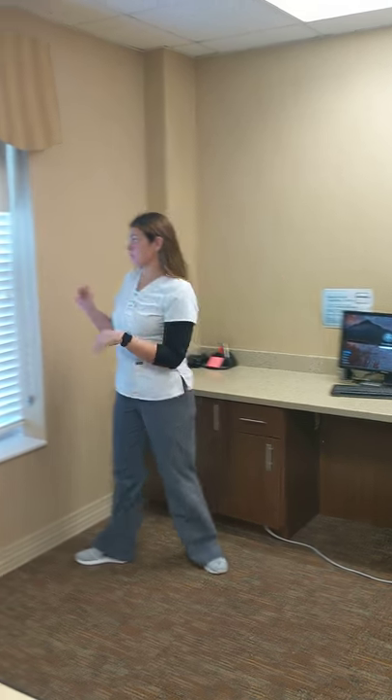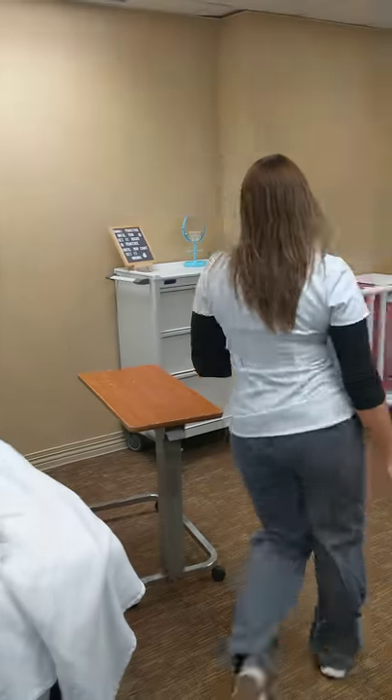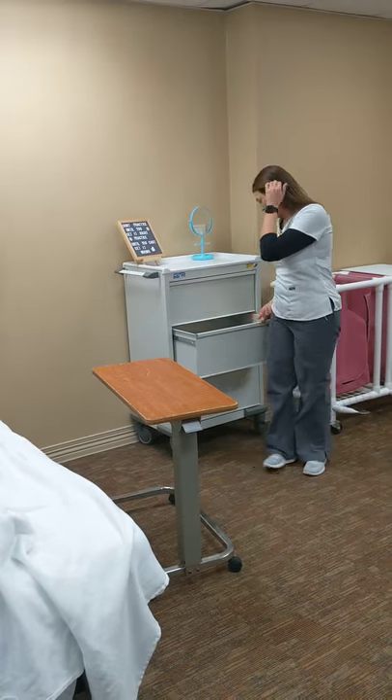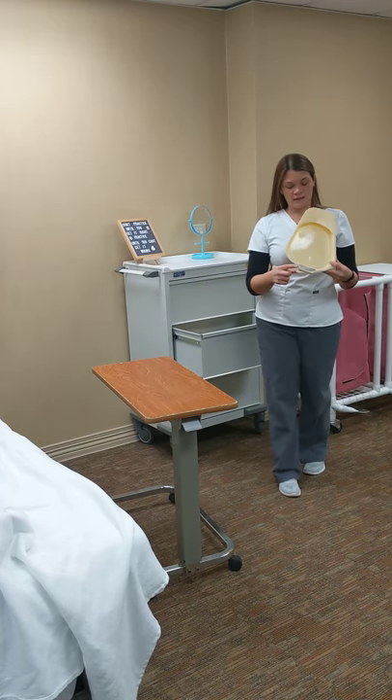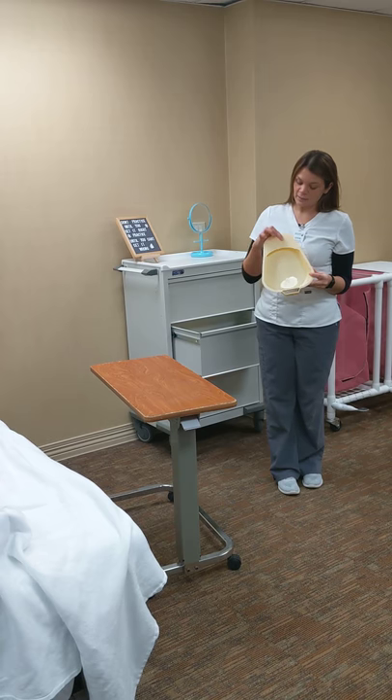I need to go to the bathroom. Okay, so we're going to put our patient on the bedpan. I've washed my hands, and we're going to provide her with privacy. So you have two different bedpans. You have a fracture bedpan. The handle here is going to go toward the foot of the bed, and this part goes under your patient.